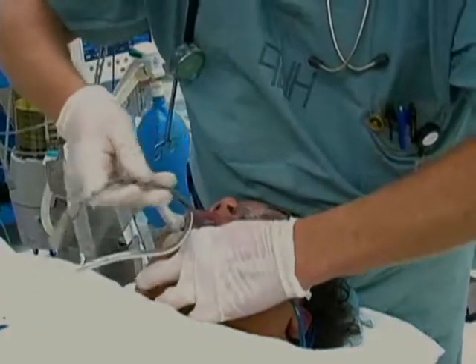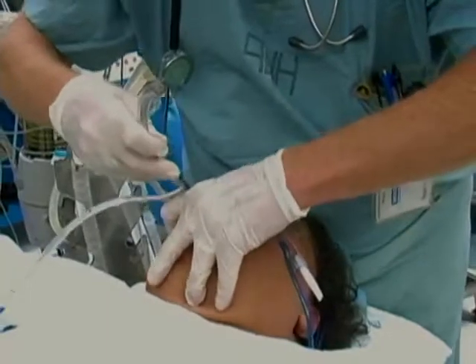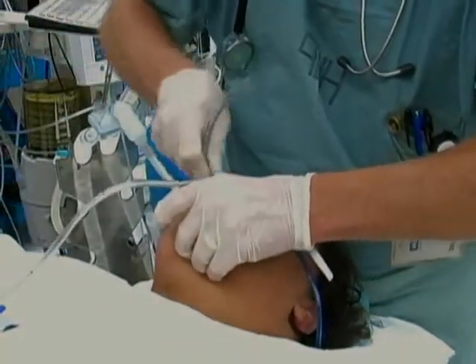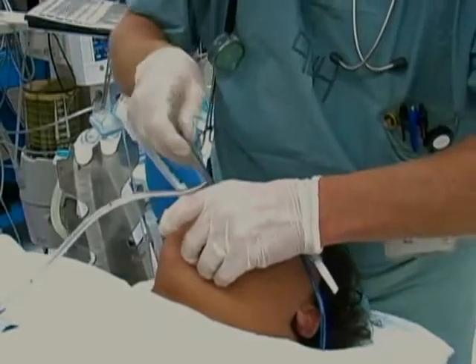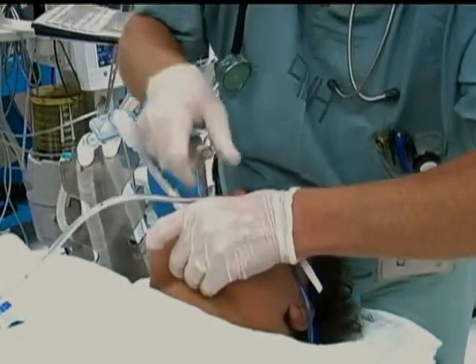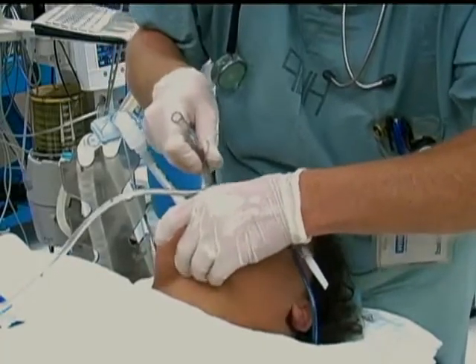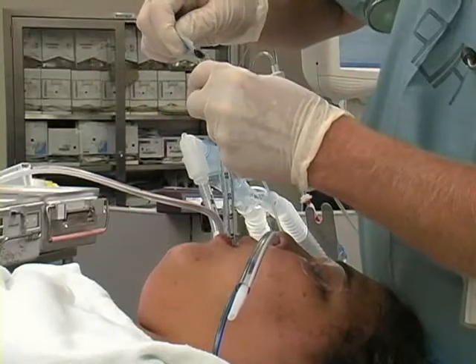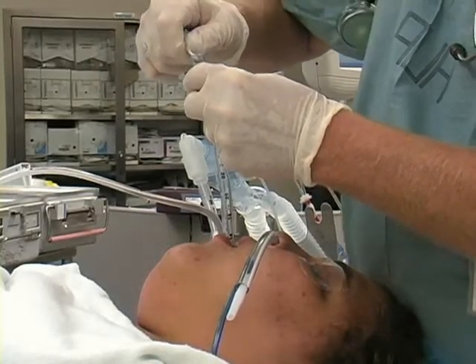Gently place the longitudinally cut endotracheal tube into the mouth and insert it behind the already placed endotracheal tube, which is located in the trachea. As you push the second endotracheal tube forward, it will advance into the esophagus. Generously lubricate the cut endotracheal tube.